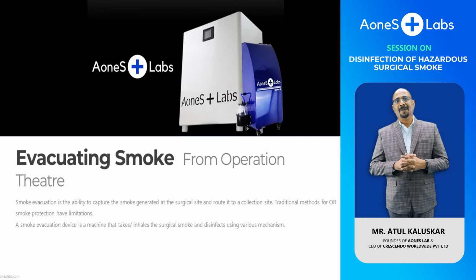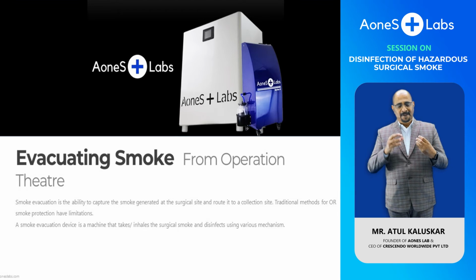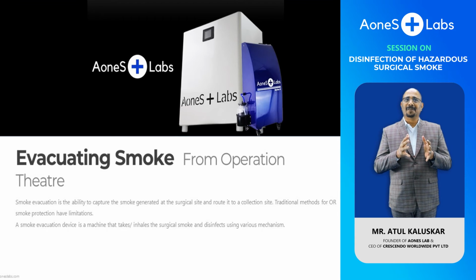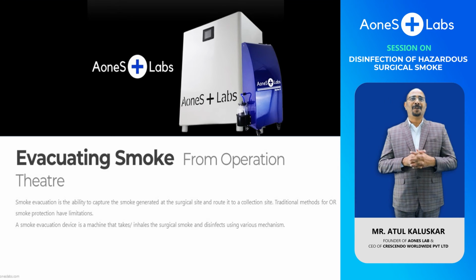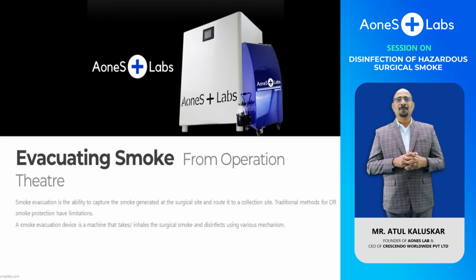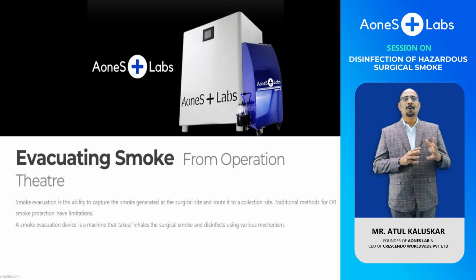What is a smoke evacuation device? It's a machine that takes in the surgical smoke, disinfects it using various mechanisms inside, filters it, and lets it out. For minimally invasive surgeries, the trocar is connected to such a device, and for open surgeries, a special holder, called a clip-on or cautery pencil holder, is used for resting the cautery pencil, which is used to coagulate cut tissues and dissect the tissues, and at the same time is connected to the smoke evacuation device by rubber tubing.